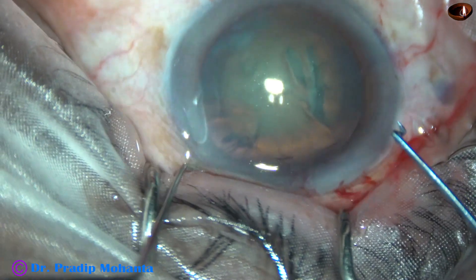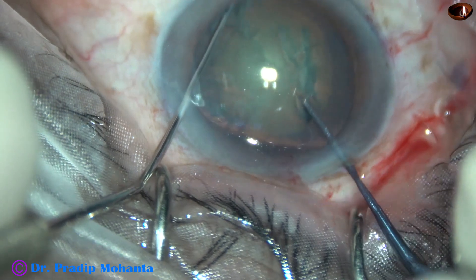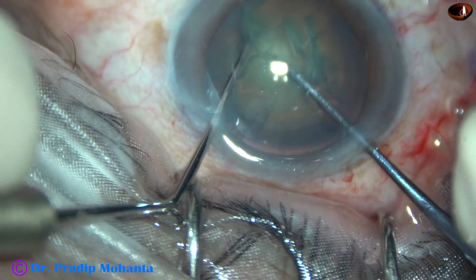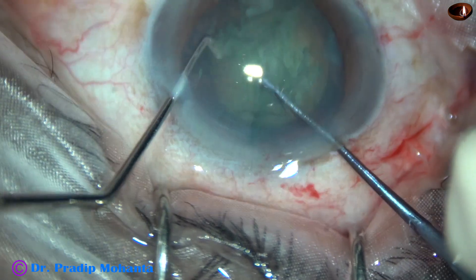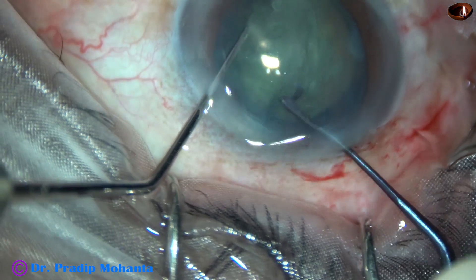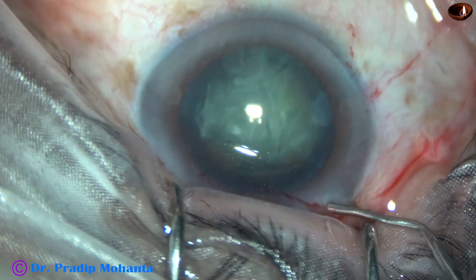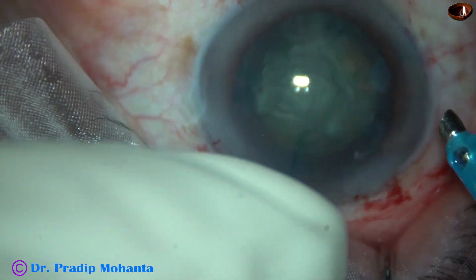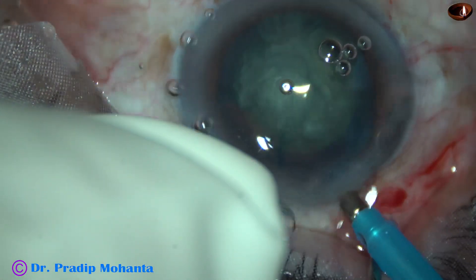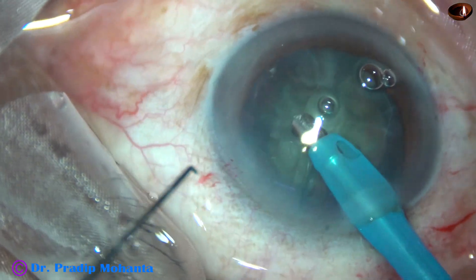And now this is the fourth case. Here goes the pre-chopper. Two instruments make opposing forces and the nucleus divides into two hemi-nuclei. One hemi-nucleus was attempted to divide further but it didn't happen — but it doesn't matter. Once we have divided the nucleus into two pieces in soft cataracts, we can see the case is 90% done. So for soft cataracts, this pre-chopper is a very useful instrument.